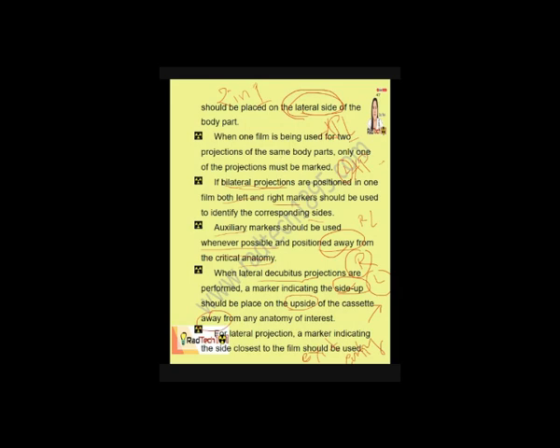So sabi dito, kapag lateral decubitus, di ba nakatagilid yung patient, and then yung ating x-ray tube, if you can still remember, nasa gilid. So, horizontal yung ating x-ray beam. So, dapat, pag naglagay tayo ng marker, it should indicate which part of the patient is up.